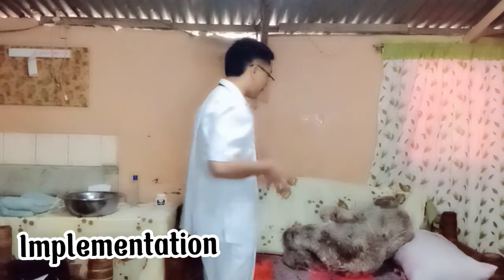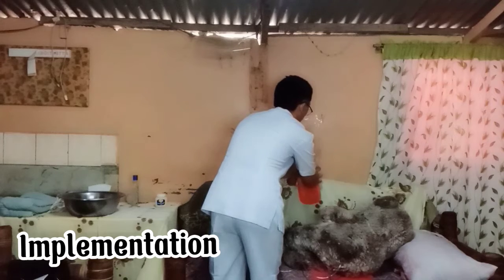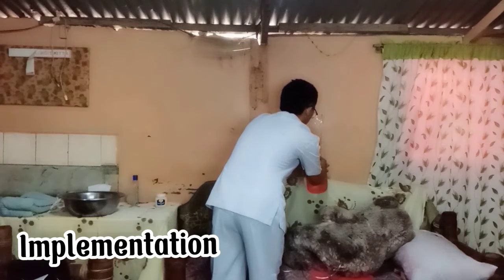After that, check for any stool that might have blocked the tube during insertion. If present, flush it, then retry the procedure. If resistance persists, end the procedure and report the resistance to the healthcare provider and to the nurse in charge. Then slowly administer the enema solution properly. Okay, so we're going to administer now the enema solution.